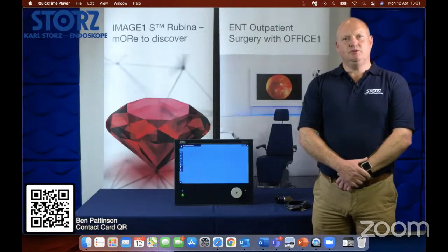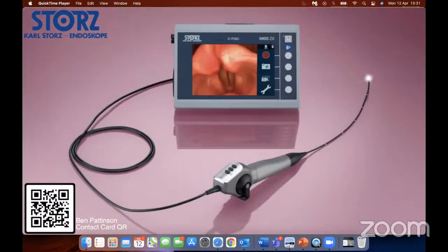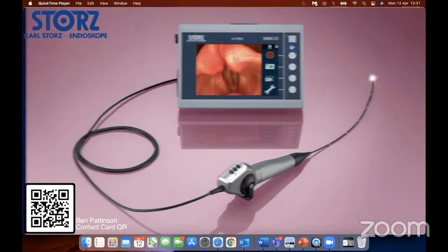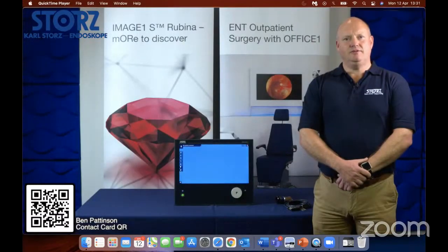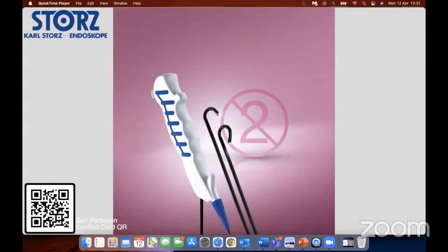The system will also connect to a lower cost video flexible nasal endoscope, which is cost-wise very similar to a fibre optic scope. However, the features mentioned before are not available on that particular scope. And if needs be, there is a single-use endoscope which also connects to the system.